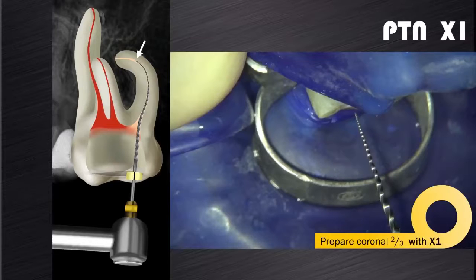After irrigation, recapitulation and a re-irrigation cycle, it is time to introduce the ProTaper Next X1 file into this challenging anatomy of this canal. In some cases, you might find that the ProTaper Next X1 progresses normally down the complex canal, but in some cases, you will feel from the tactile feedback, despite the coronal brushing motions, that the file still hangs up and does not really want to progress.